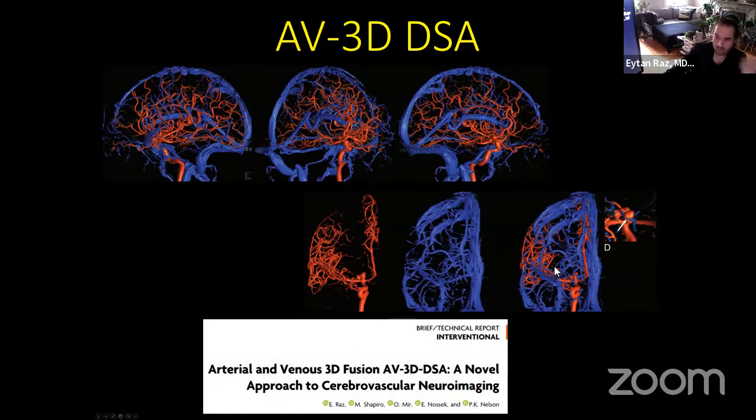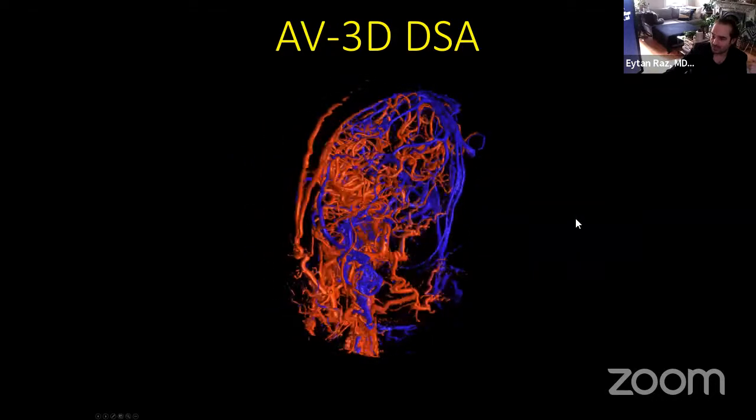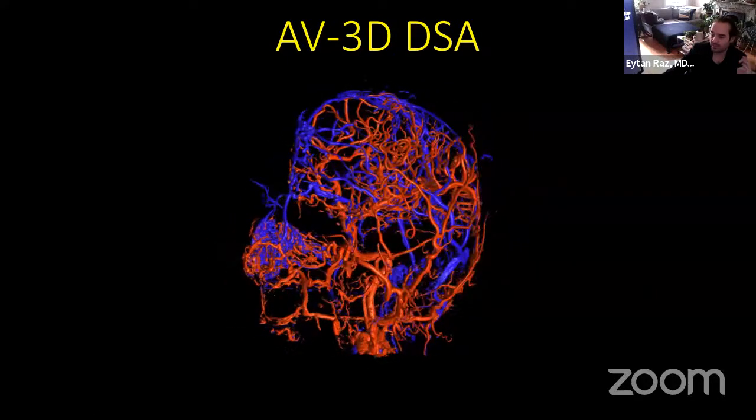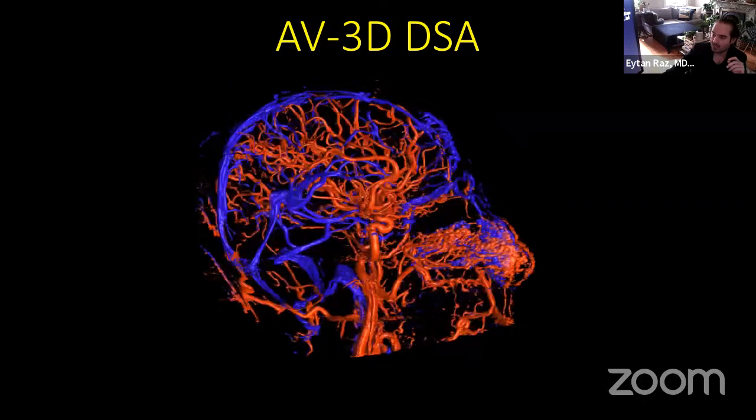Something that we put together that we find sometimes useful, and you can create very good representations of these. No question how beautiful they are, how useful they are. It depends really on the role. I'm sure you guys can find some role for this.